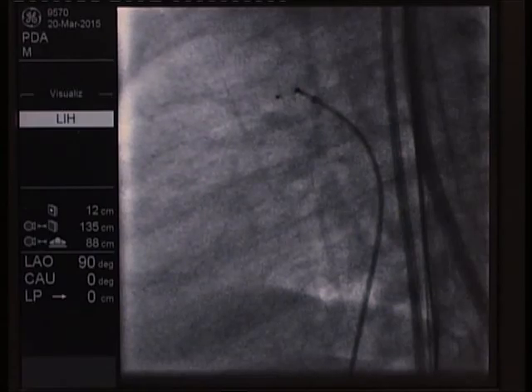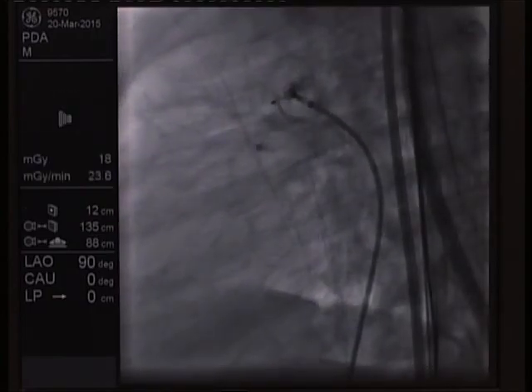Yeah, so did you understand that? In our institution, we do not put a catheter up into the pulmonary artery until the angiogram is done. We don't touch the duct until the angiogram is done, and then we make a decision. Did you hear the question? Was there manipulation in the pulmonary artery or somewhere close to the ductus before the angiogram was performed?